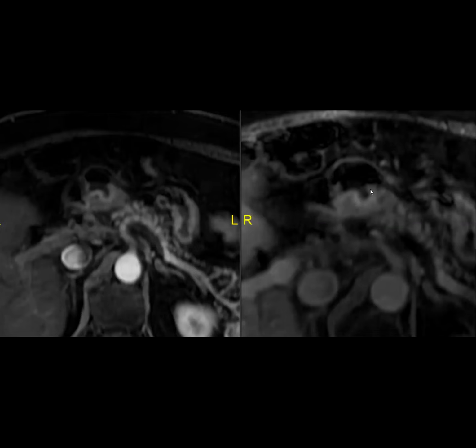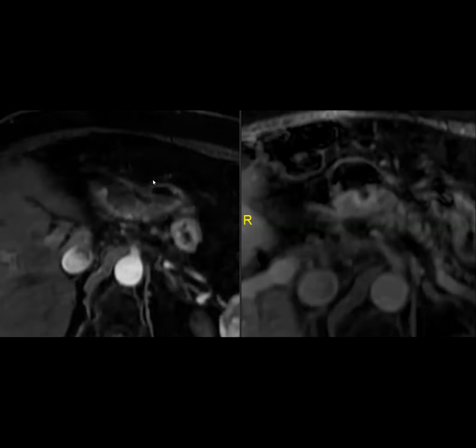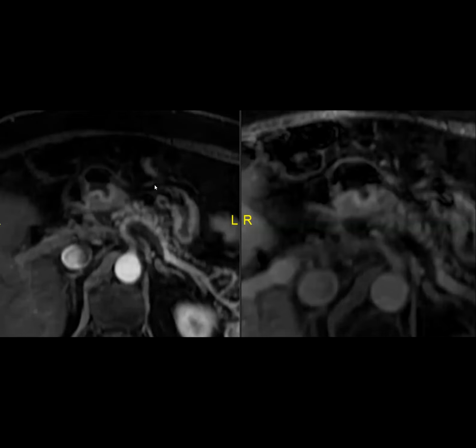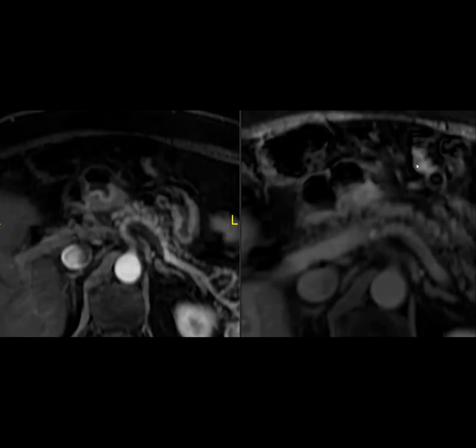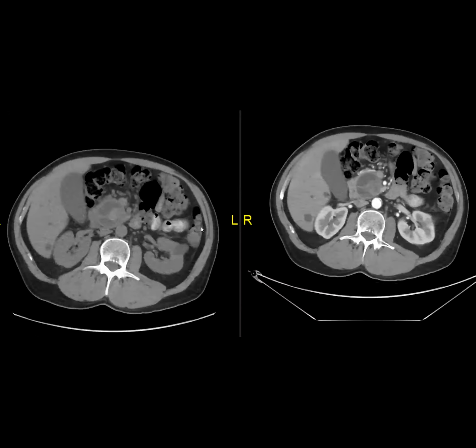But then when you see this very nice sharp edge of the overhanging edge, and you can see here, this is just very thin enhancement. It looks benign, the mucosa itself looks really smooth. So I think that's just going to be a benign ulcer, but it's very cute. I said that they need to correlate with symptoms and stuff.